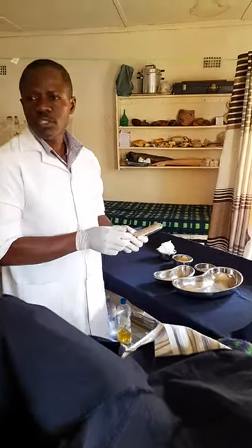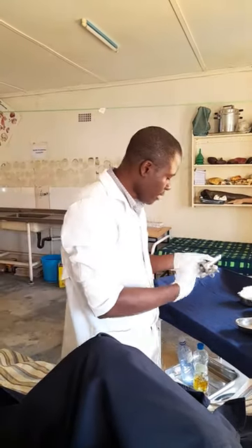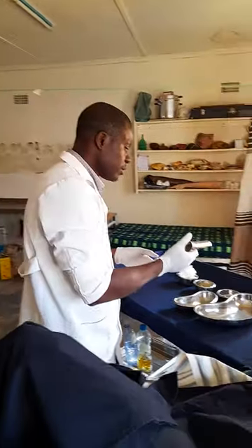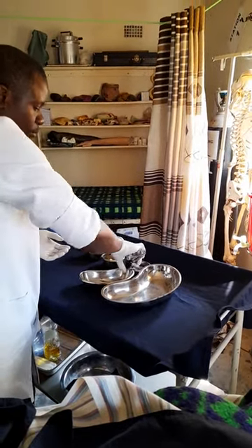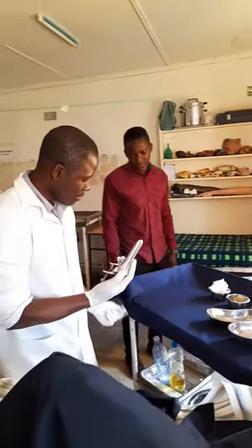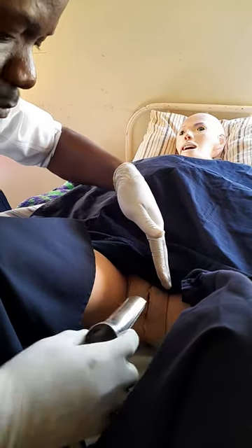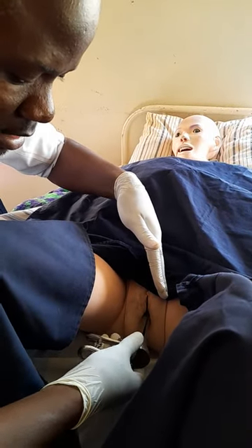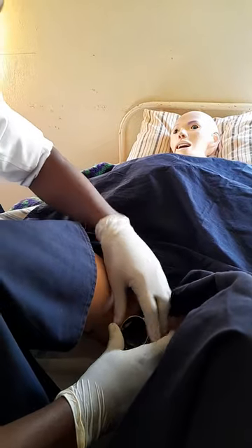Now prepare the speculum. Ask your assistant to give you the collection swab. Dip the speculum in obstetric cream. Because the vagina goes longitudinally, you insert the speculum sideways — not straight in. Once you reach the intended point, rotate it, then open the speculum.